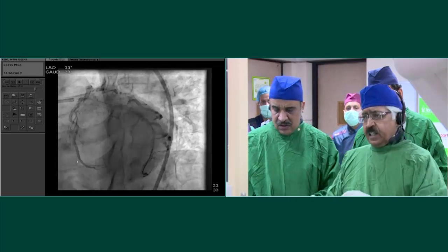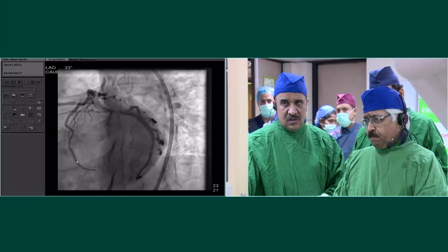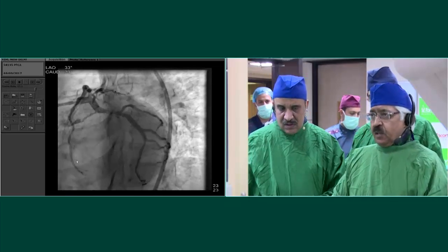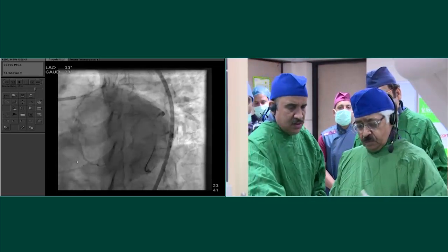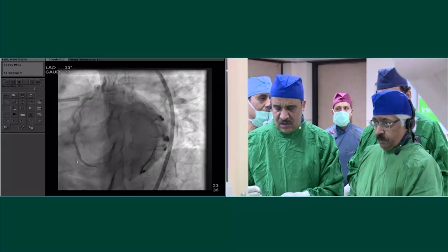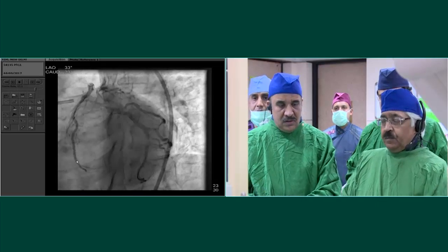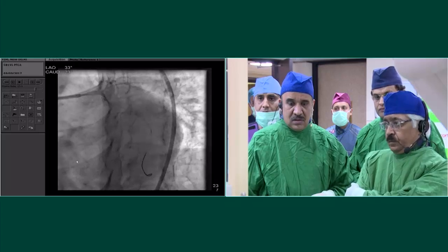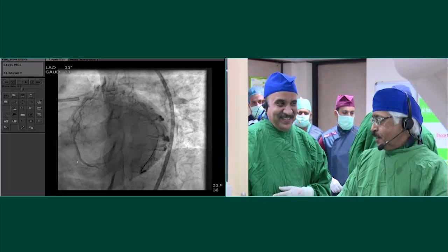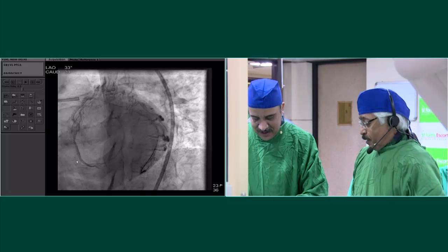Yeah. So you would want me to leave it at this stage? No, okay, right. Okay. I'm just worried that he's a young person who must have soft plaques. But anyway, we got a 0.9, and had it been 0.85, I may have been tempted, but 0.9 is 0.9.